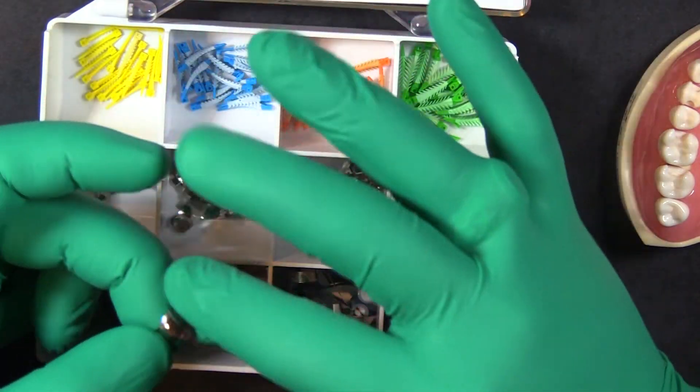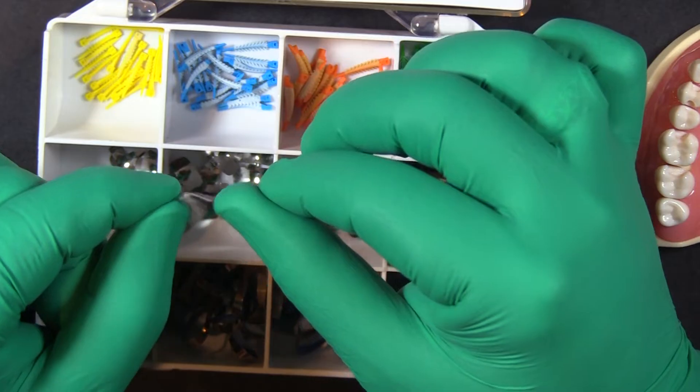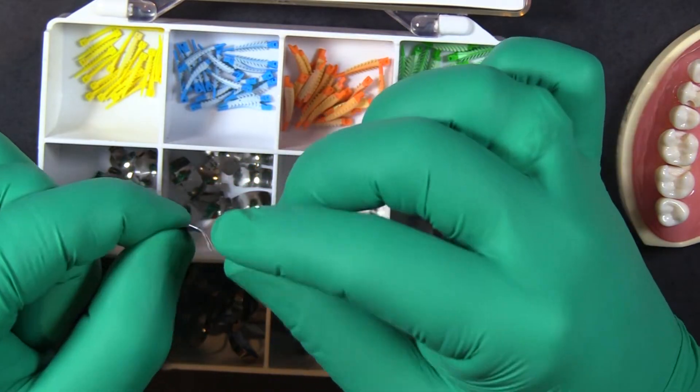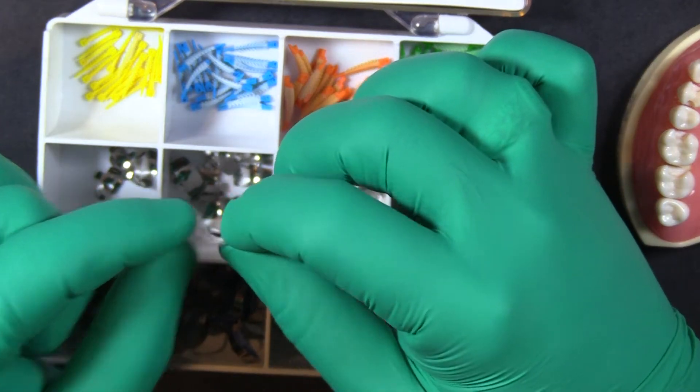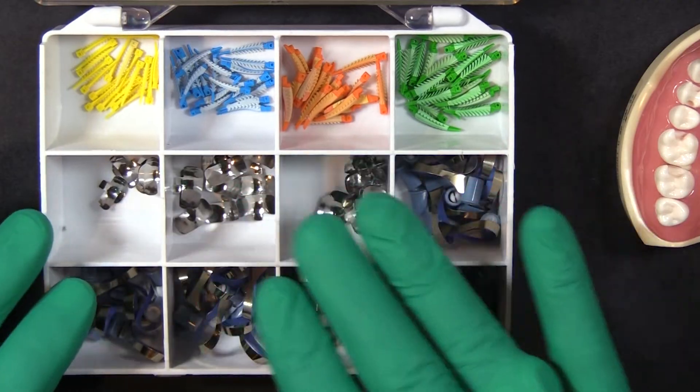These matrix bands are a different material than the typical dead soft material. You can see they have a lot of memory to them — they're much more rigid and firm, and that's going to help us out with these subgingival restorations where we want to elevate the margin a little bit. We'll go through pros and cons and when one might be better than the other.